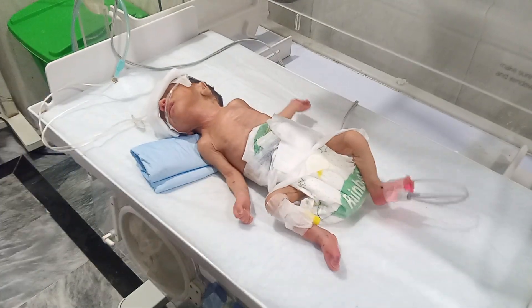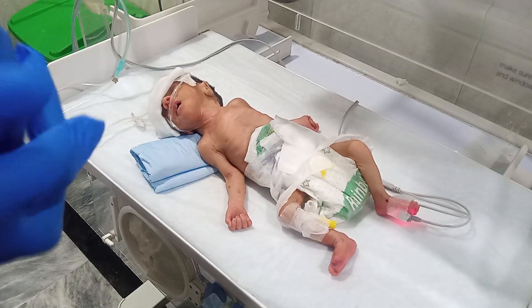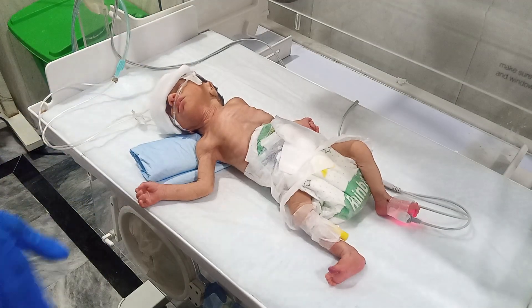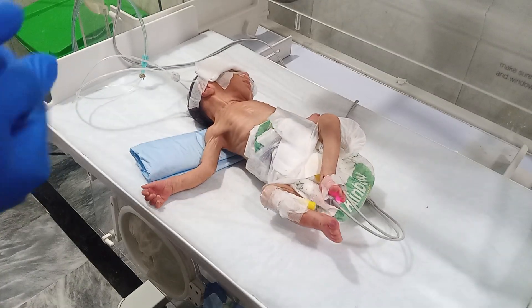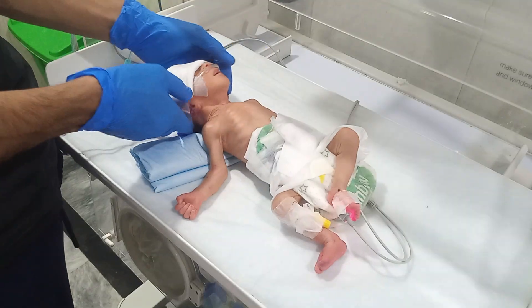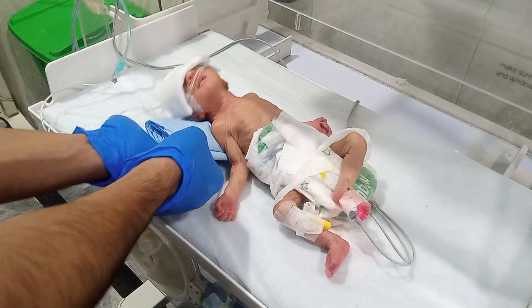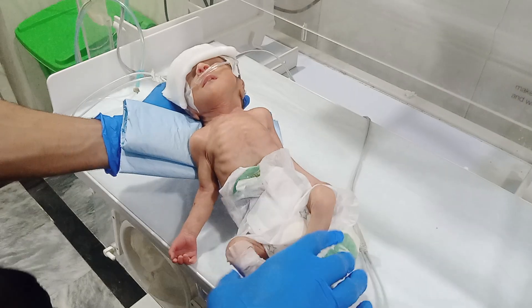We will start feeding for the baby in two to three days. We are giving incubator care, which is very important for the preterm baby — to maintain heat, temperature, and oxygen levels. You can check the condition of this baby.